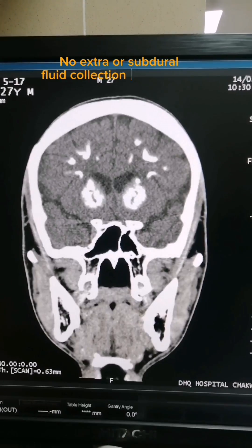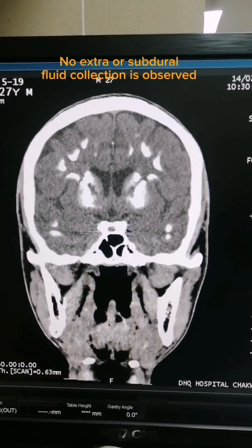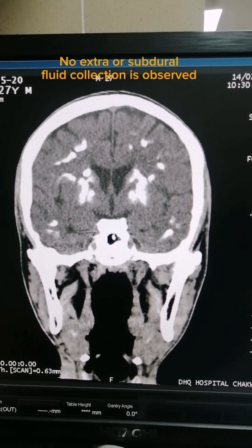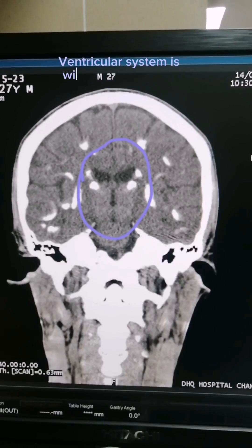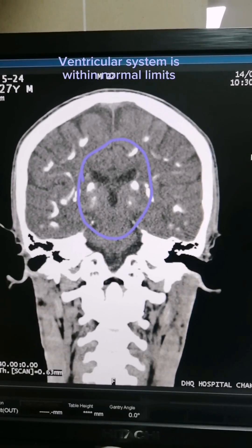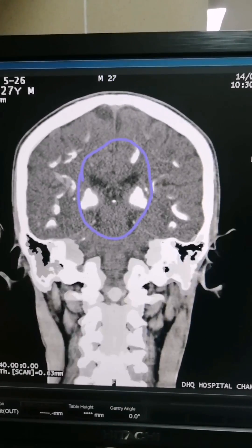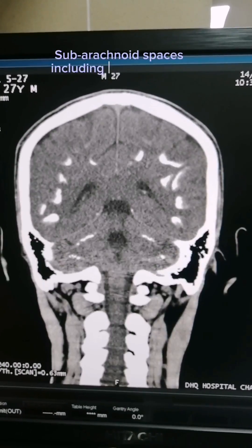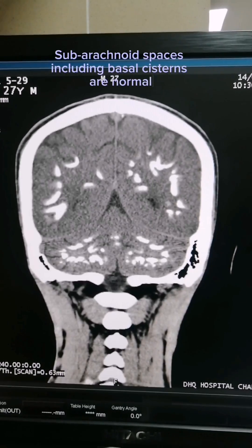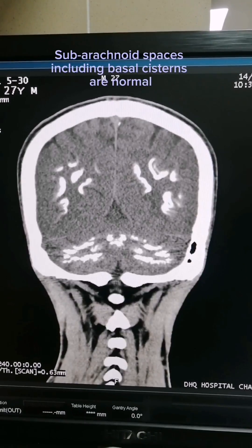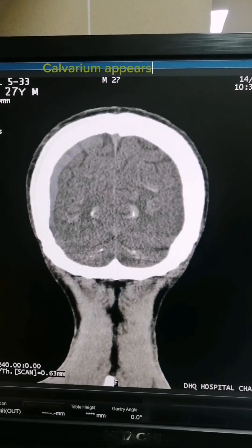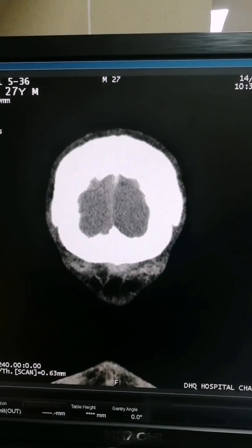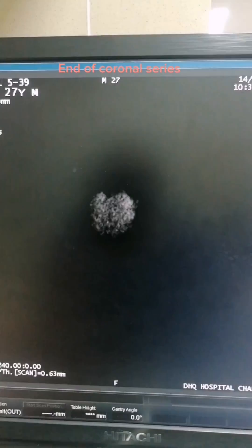No extra or subdural fluid collection is observed. The ventricular system is within normal limits. Subarachnoid spaces including basal cisterns are normal. Calvarium appears normal. End of coronal series.